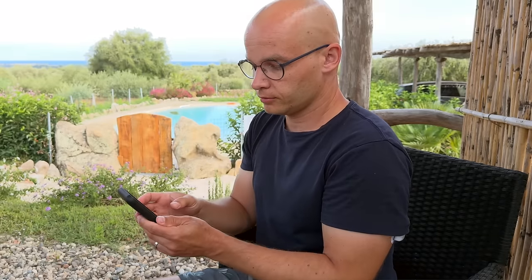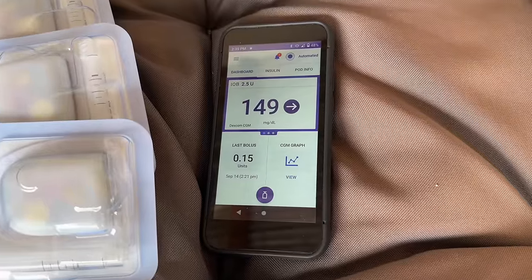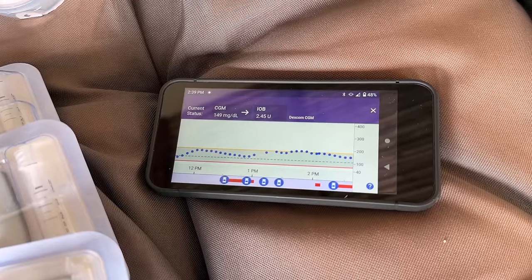Whenever I want to eat or give myself insulin with the T-Slim, I just pull up the pump and do it. With the Omnipod 5 and a smartphone or controller it's a completely different experience — it's not hooked up to me and I've forgotten it at home many times. When I want to quickly check my blood sugar I need to pull out my phone, and something else might grab my attention. To be fair, both systems have powerful algorithms that adjust basal insulin delivery, so you don't need to check your blood sugar all the time — the algorithms are designed to keep blood sugar in control.